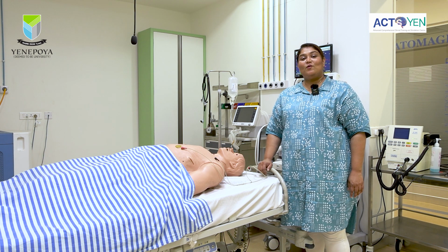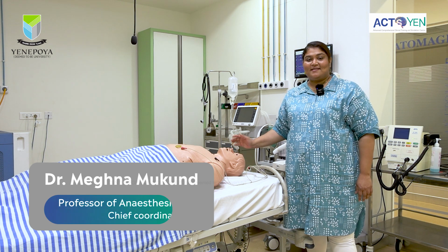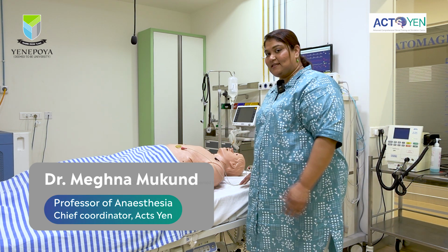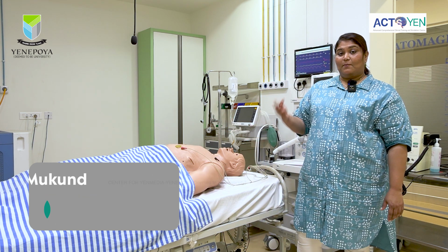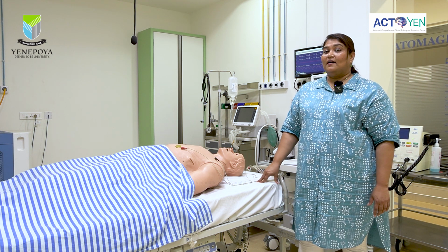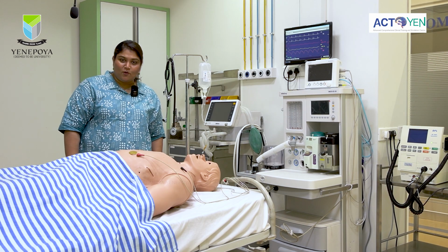Hello everyone, we are with HPS, the Human Patient Simulator. HPS is a high fidelity mannequin that is realistic and lifelike, like you can see. The room that houses the HPS could be a mock OR setting, a mock ICU setting or a mock ER setting with their respective equipment. Let's explore the features of HPS.